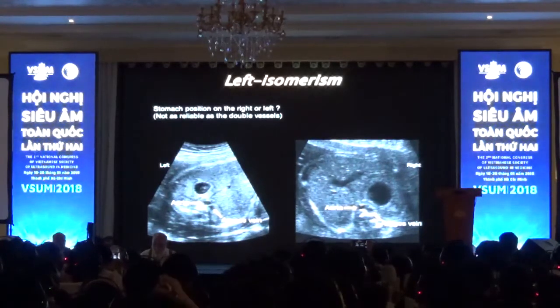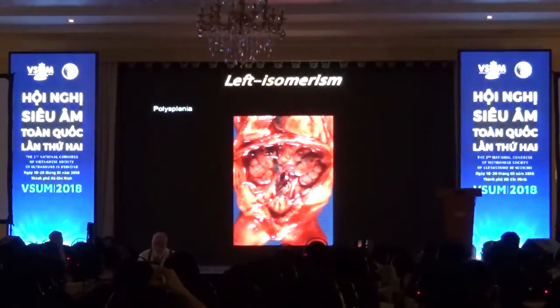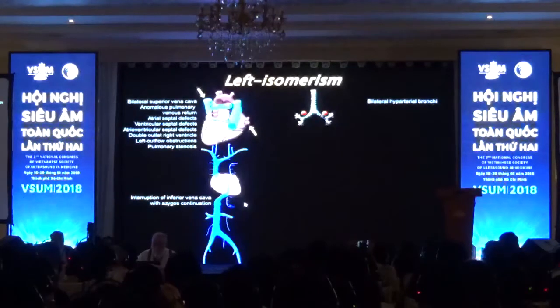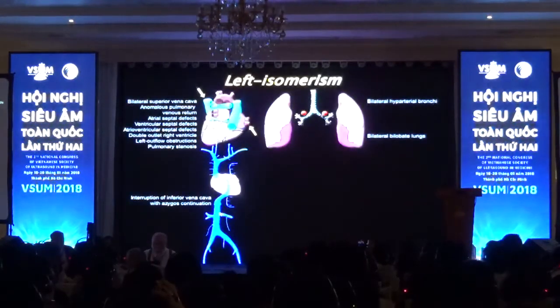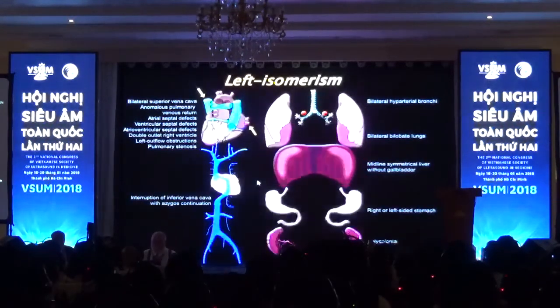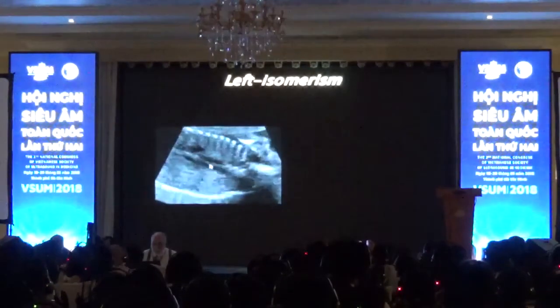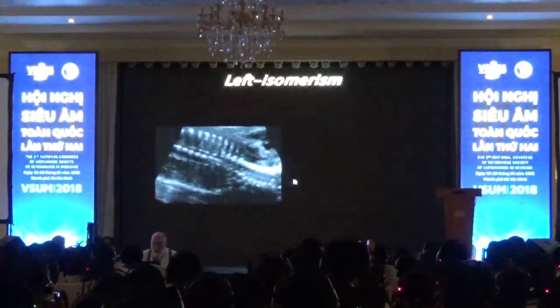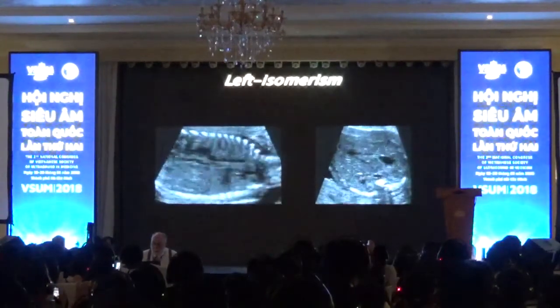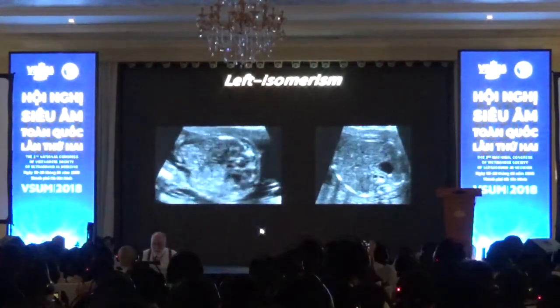So here we have aorta and azygos vein next to each other. Baby can have polysplenia, but this is hard to see with ultrasound. And these are the important findings in that isomerism. So IVC interruption is really the one you want to be looking at. And then let me finish by showing you some clips. Here we have the two vessels in the chest, the two vessels side by side next to the spine. Very typical of IVC interruption.